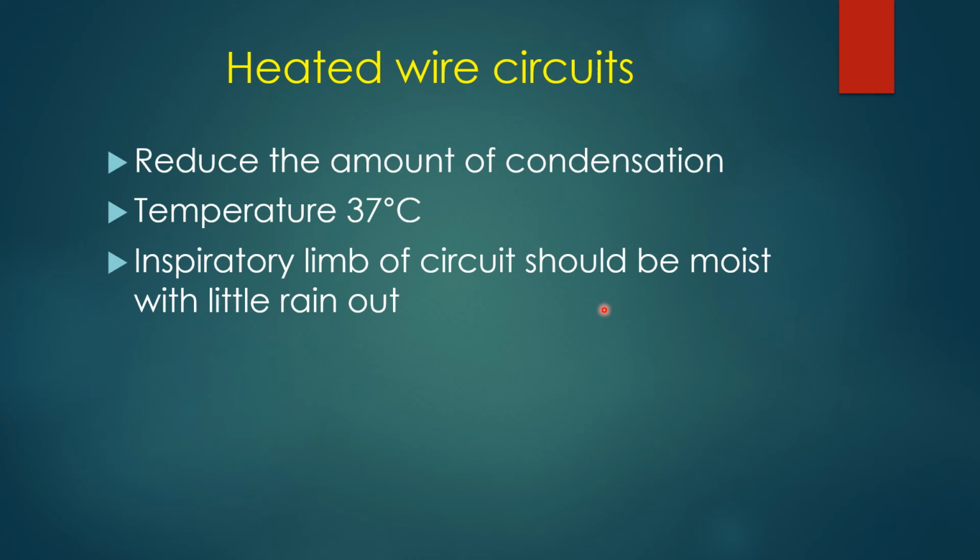What if it's dry and the humidifier seems to be set appropriately, but then you notice that there's no water? Most of our ventilators today regulate the flow of water into it and will alarm if it runs out, but not all of them do. So if it runs out of water, then the patient's being ventilated with dry, heated gas, and that can cause permanent structural damage to the mucosa in a very short amount of time. So you want to understand the heated wire circuits in more detail than just, well, it prevents condensation, because that's a wrong way to think.